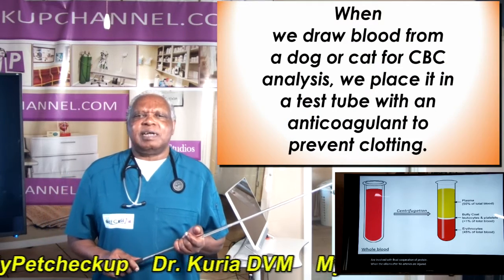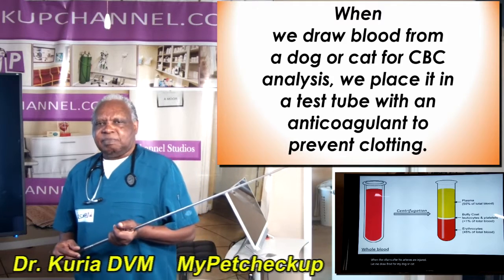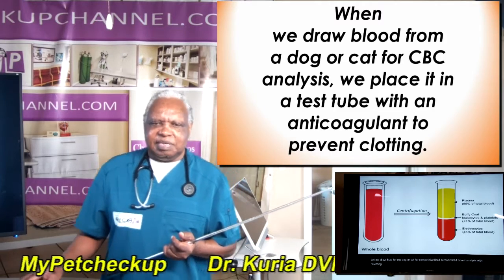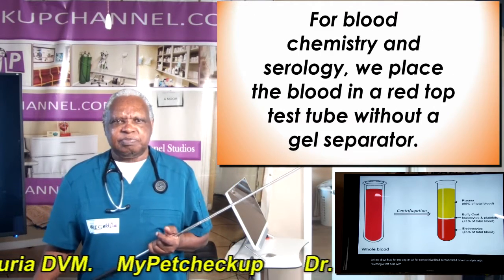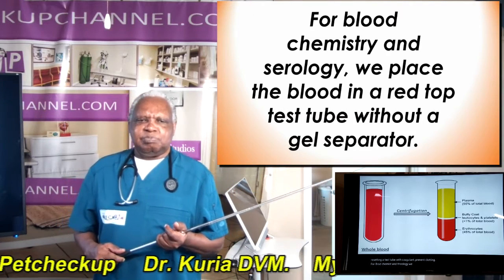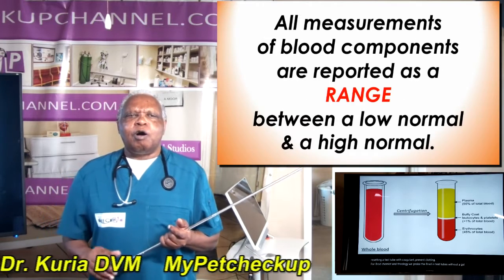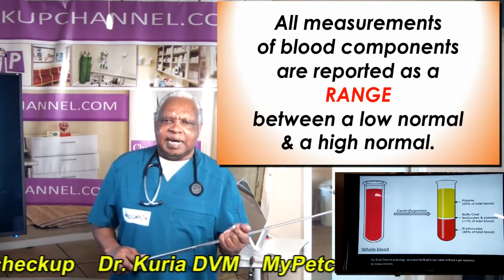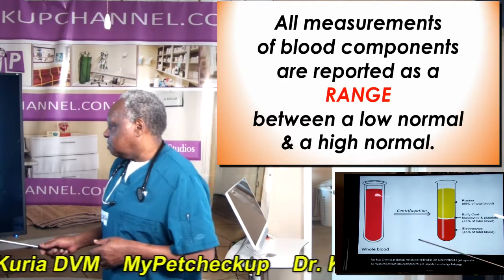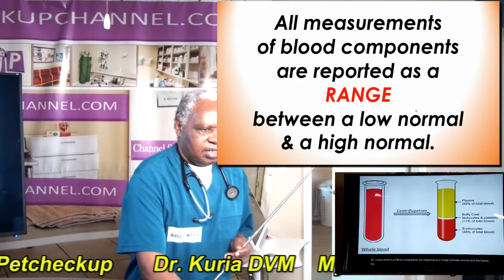When we draw blood from a dog or cat for complete blood count analysis, we place it in a test tube with an anticoagulant to prevent clotting. For blood chemistry and serology, we place the blood in red test tubes without a gel separator. All measurements of blood components are reported as a range between a low normal and a high normal.